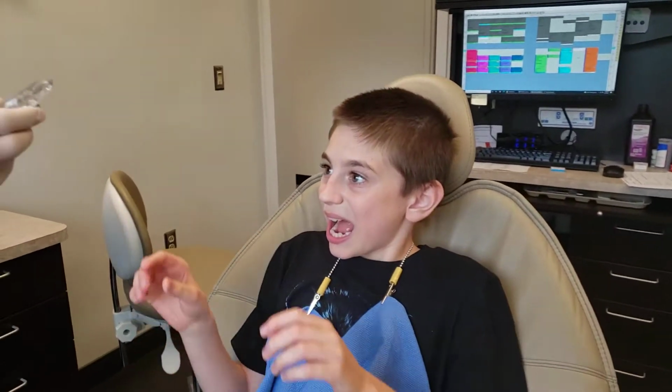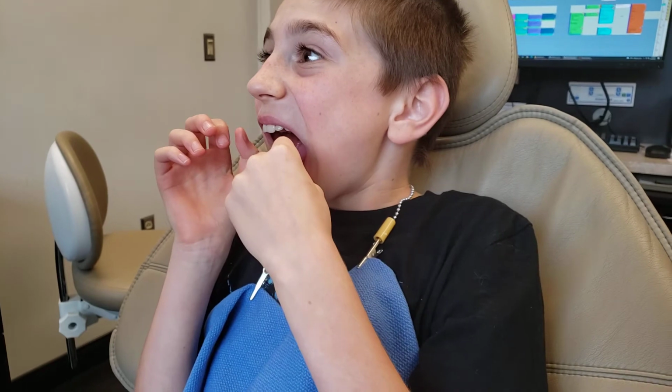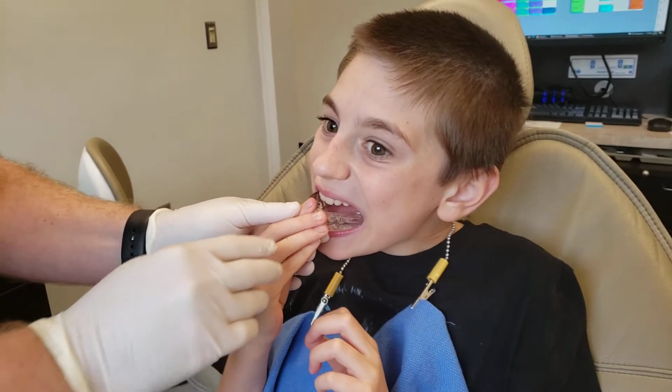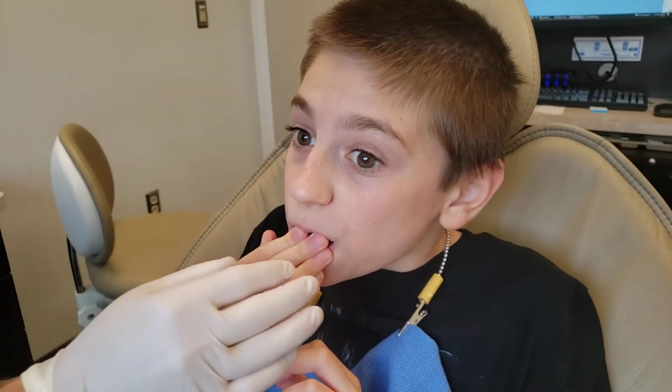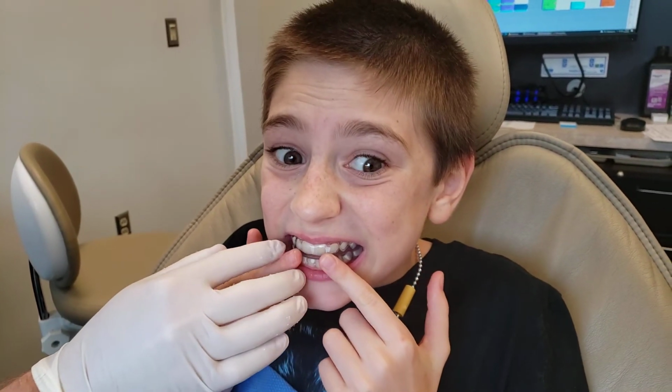All right, try that again. Let me see. Which hand do you use, your right hand or your left hand, for most things? Both. All right. Well, let's put your finger right there and your thumb right there, and then line it up and try to touch the middle. There. Now close your teeth together. That's perfect. Perfect, Josh.